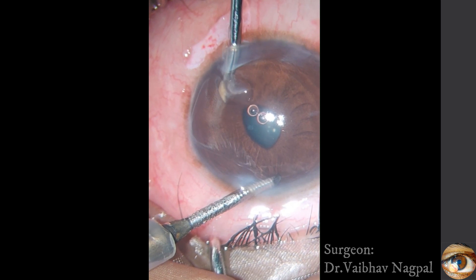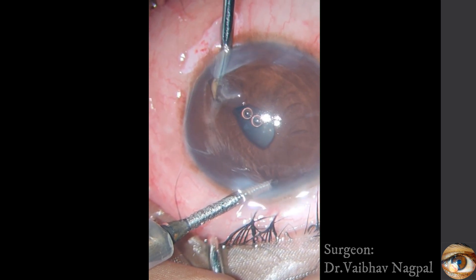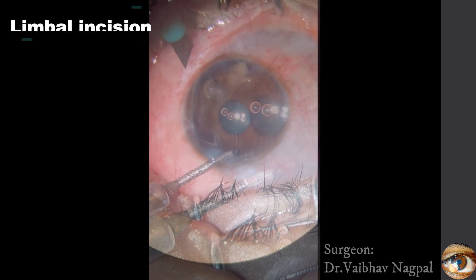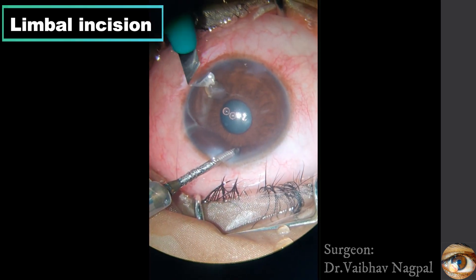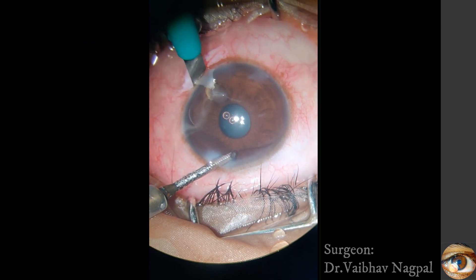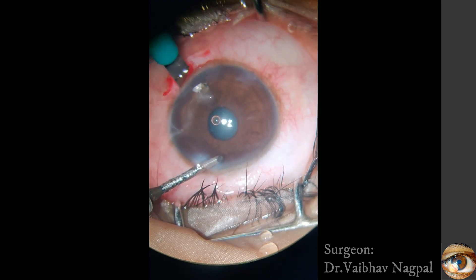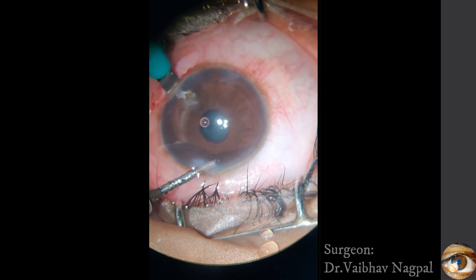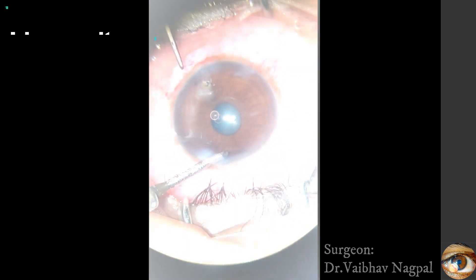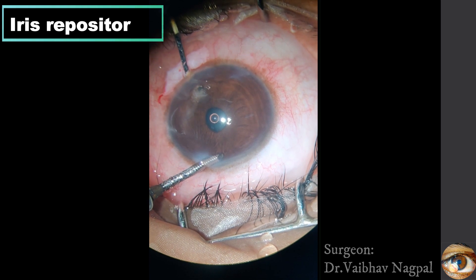As soon as the adherent nature of the foreign body is identified, this approach is aborted. A limbal incision is then made with the green blade. Iris tissue prolapse is attempted with the repositor.